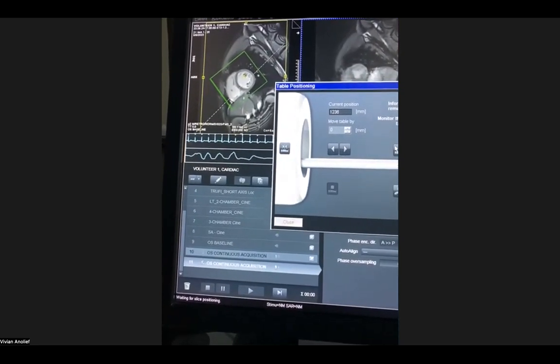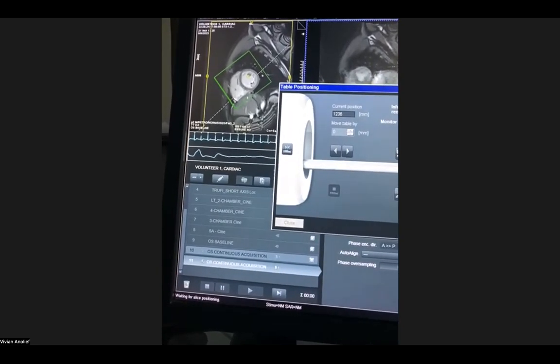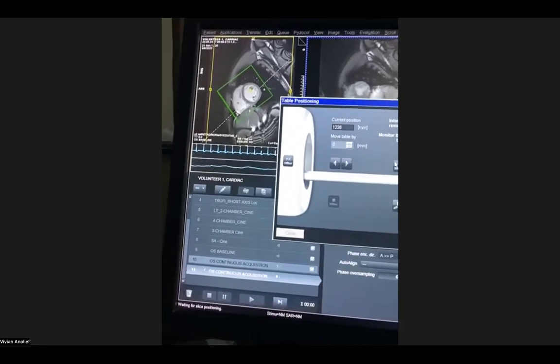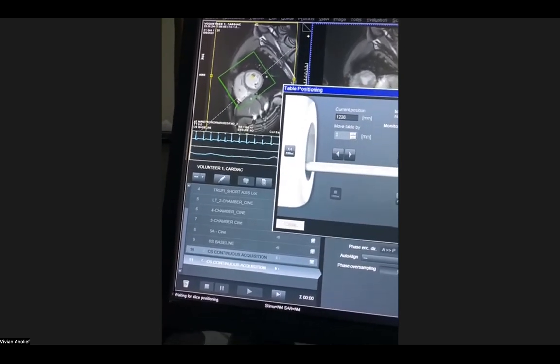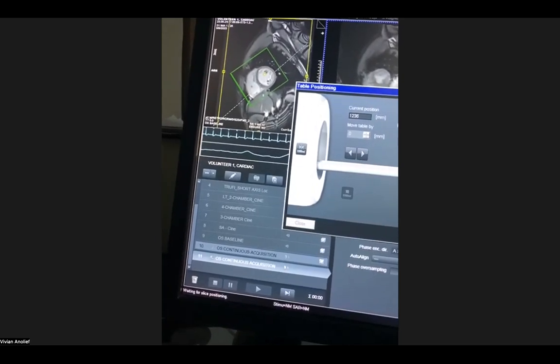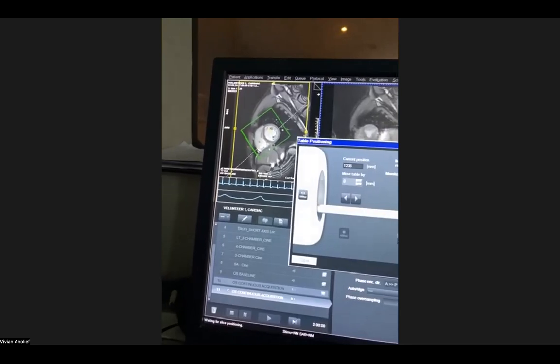Is it advisable to tell the patient that he's supposed to hold the breath for 40 seconds? Because you are going to multitask. The patient might think, well, then I need to count this, and that's going to be very difficult. It's going to add to the brain activity, and that will not help.